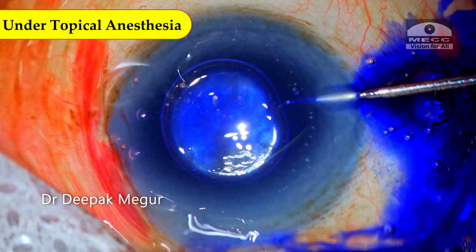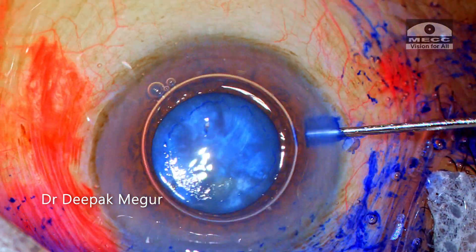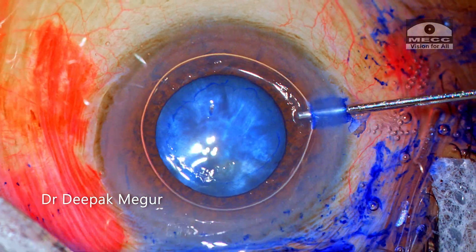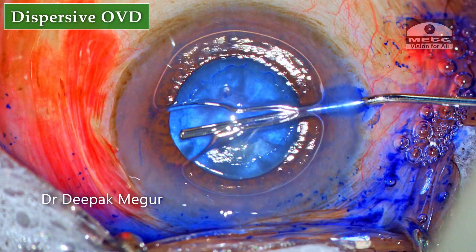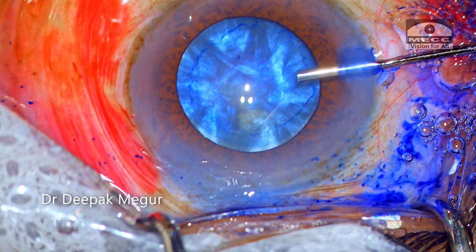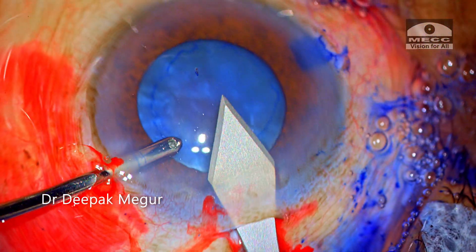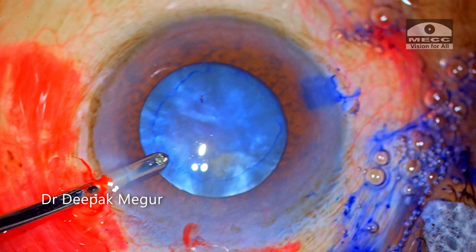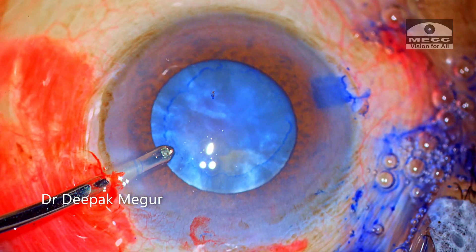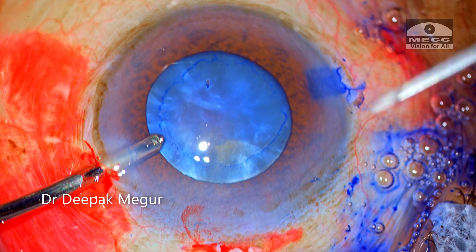The surgery is being performed under topical anesthesia, and after staining the anterior capsule, I inject about 0.3 ml of 1% preservative-free lidocaine for intracameral anesthesia. I prefer to use dispersive OVD. I am using Orocoat, which is a combination of chondroitin sulfate and sodium hyaluronate — this is a Viscoat-like OVD, the Indian version of it. I prefer dispersive OVD over cohesive OVD for rhexis in these intumescent cataracts, since the chamber is well maintained without deepening it much.